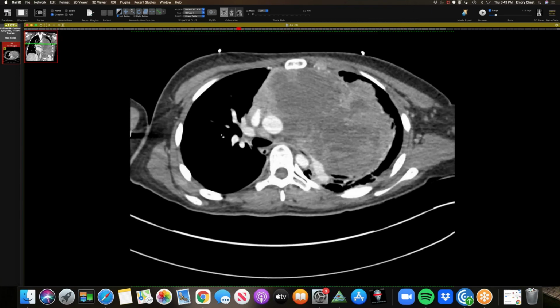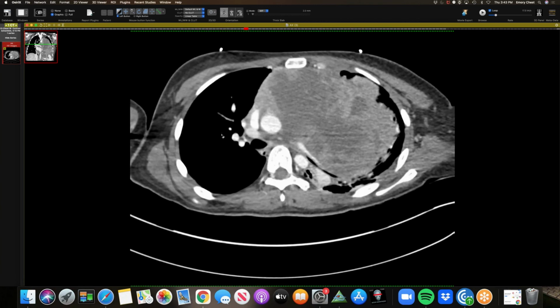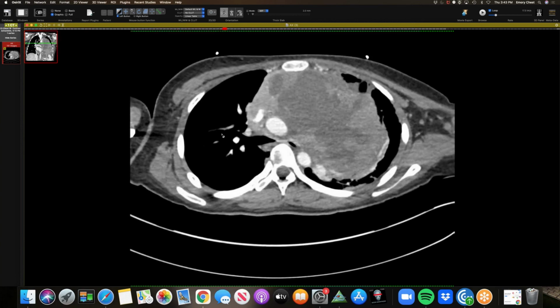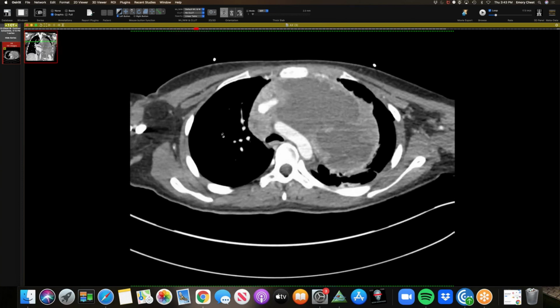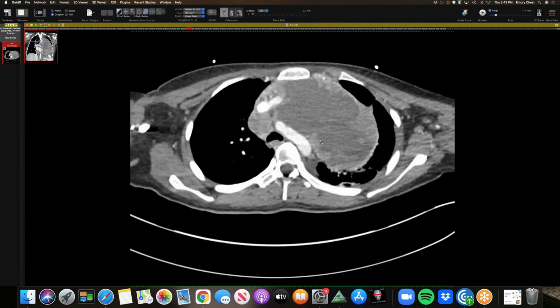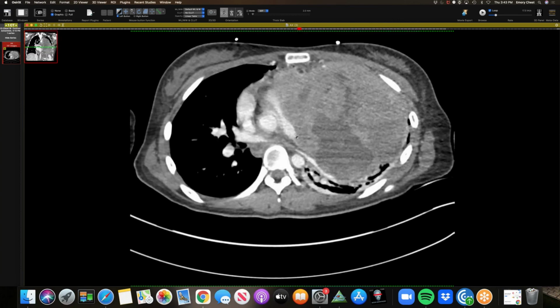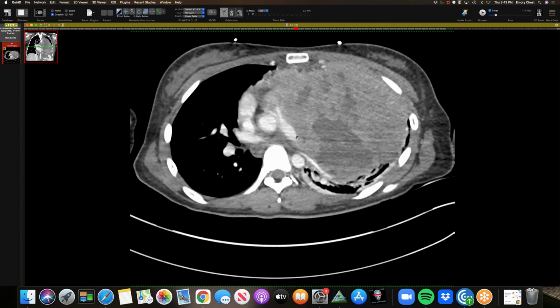20-year-old female. Do you guys have any thoughts or ideas? It looks like it's prevascular mediastinum, and she's a good age for germ cell, but is there any fat or anything? They're usually pretty well differentiated in females. Yeah, more aggressive. I would say thymic carcinoma, a sarcoma, or a very aggressive lymphoma. It'd be a very nasty lymphoma.